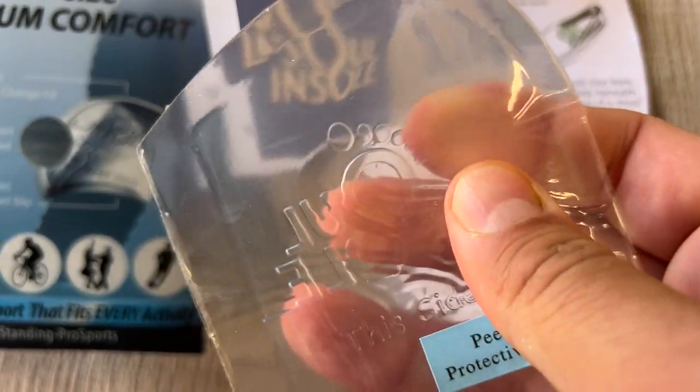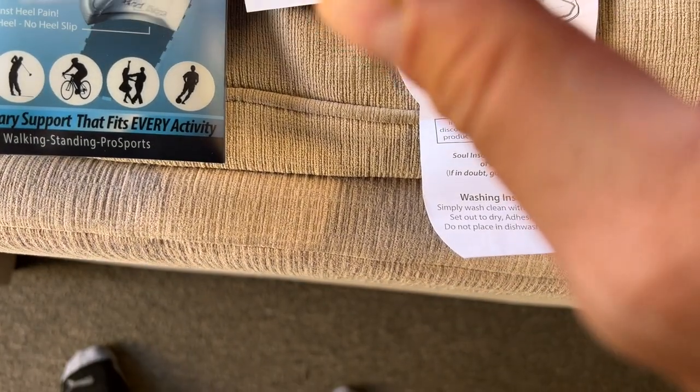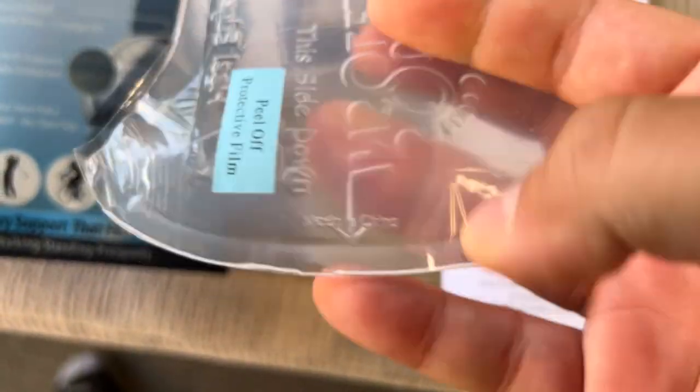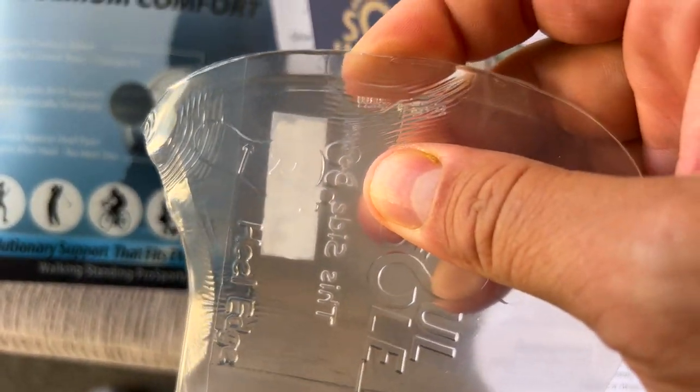This is what you do — you put this in your shoe. This one is the micro size, maximum comfort, and it's for walking, standing, and all different types of sports. I'm going to put this in my shoe right now and tell you how it feels. Let's cut with the magic of editing.